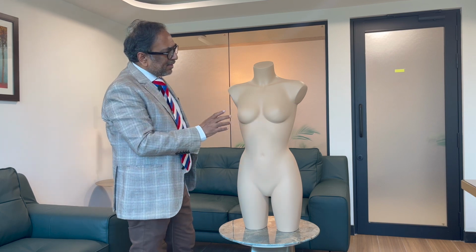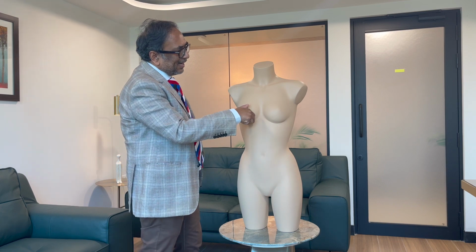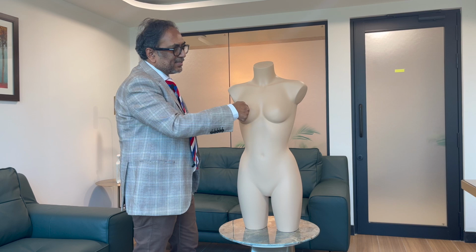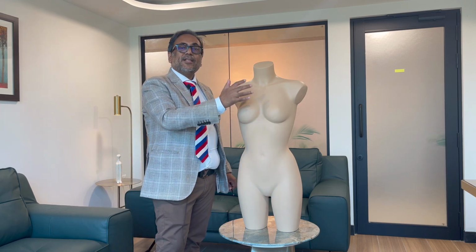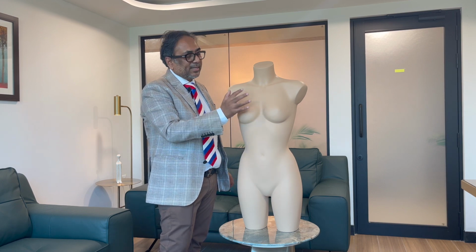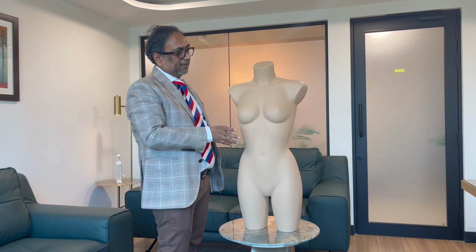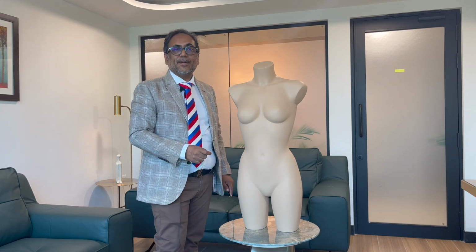Now, the other important measurement is the elasticity of the skin. We hold the breast tissue and see how much elasticity there is. This will help in determining what kind of projection the patient can take, whether it's going to be a large projection implant or a slightly under-projected implant. So the tightness of the envelope will determine what kind of projection of implants we can use for this patient.